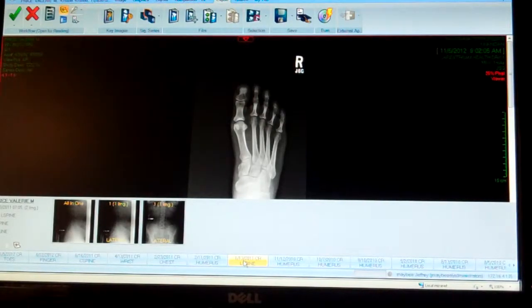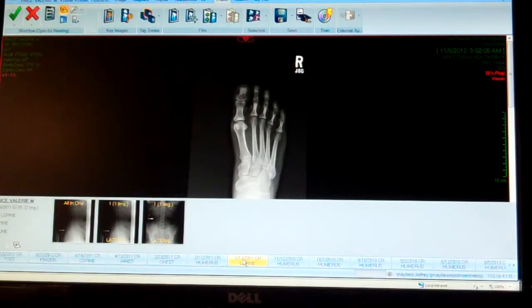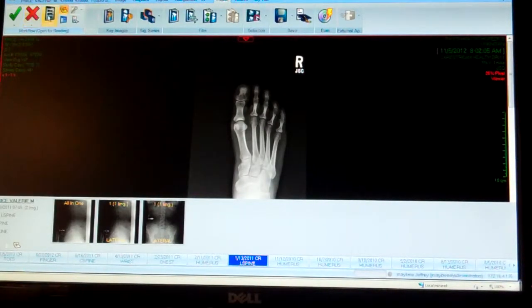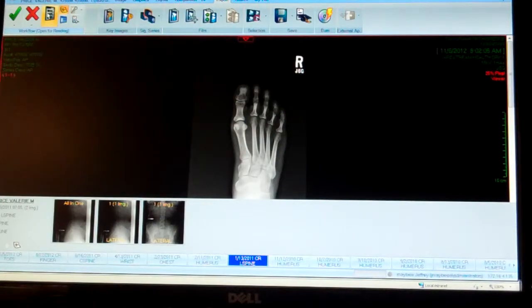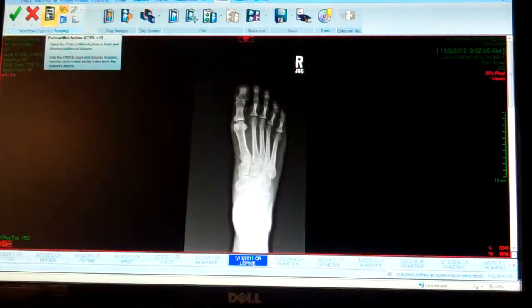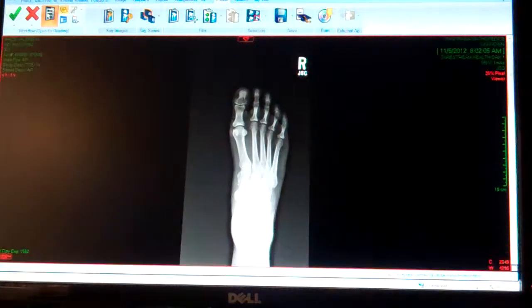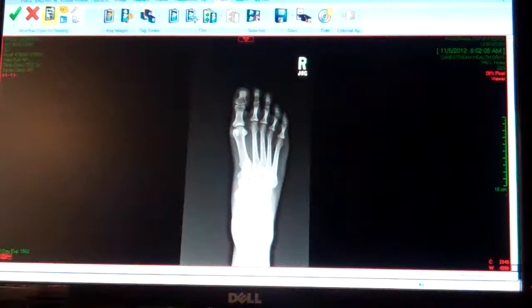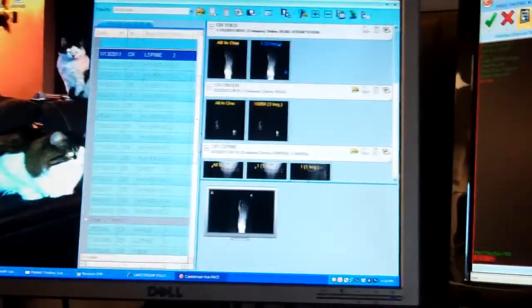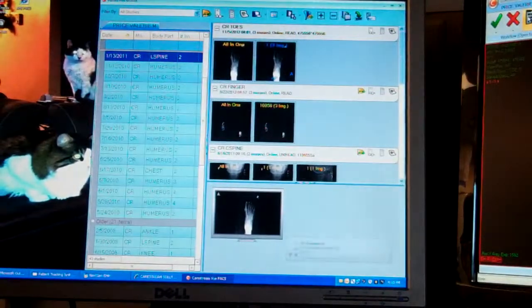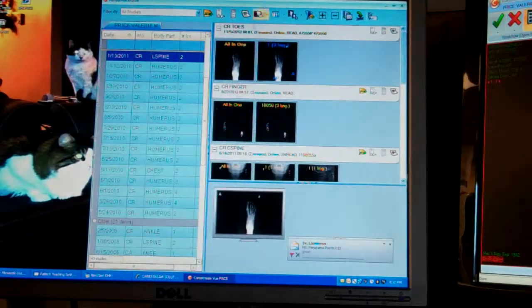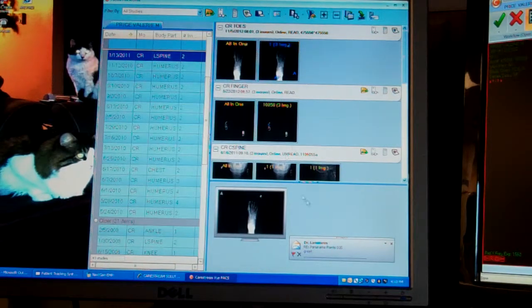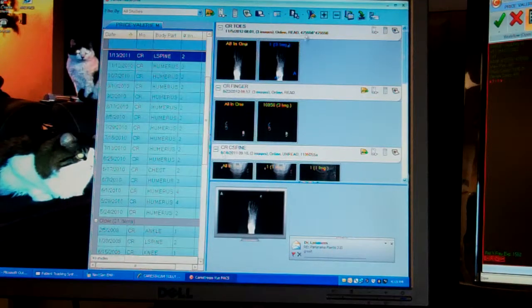If you would like to view these in full size, next to the red X is the icon for the Patient Mini Archive. You click that and it's going to pull up a much larger screen that gives them all listed by date and spreads out the images for you to see.